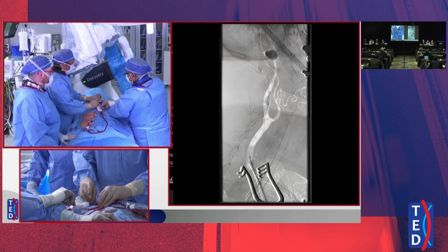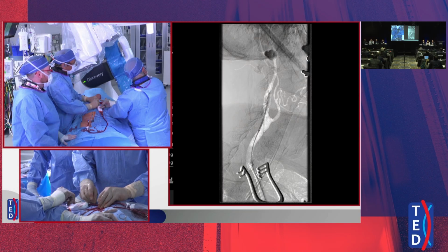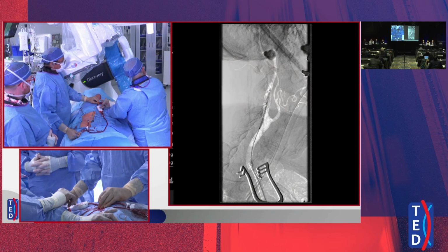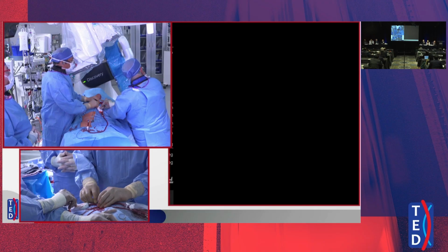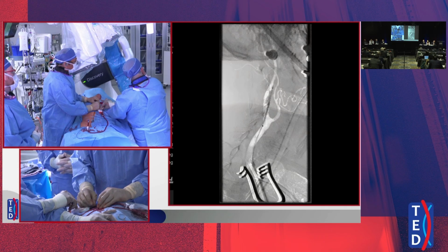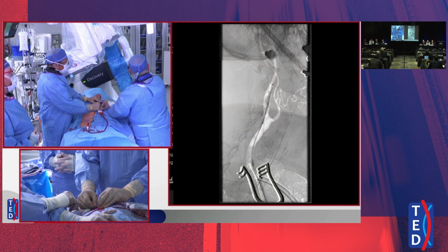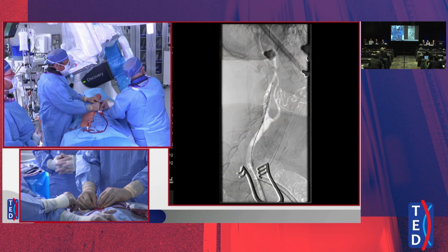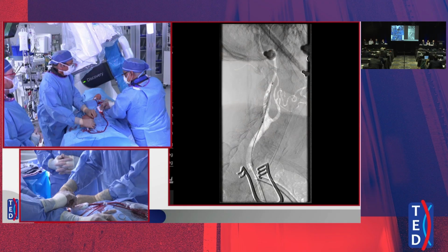The reason I want to present this case is transfemoral carotid stenting. Okay, this is a question here. How many would just land this stent in the proximal internal? This is a 9/7 stent, and just land it right here so it doesn't come into the common? Or would you land it and put a second stent into the common? How long of a stent is this, Venki? It's a 9/7/40, standard length. Okay.